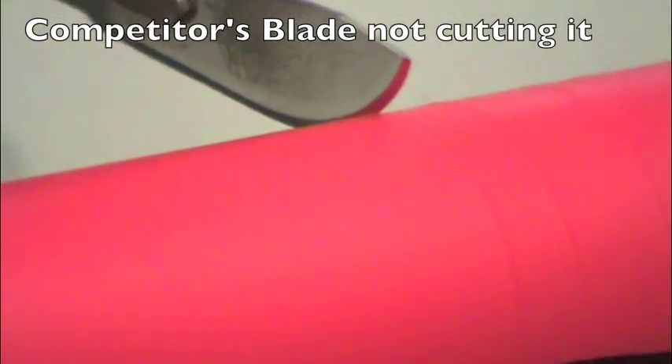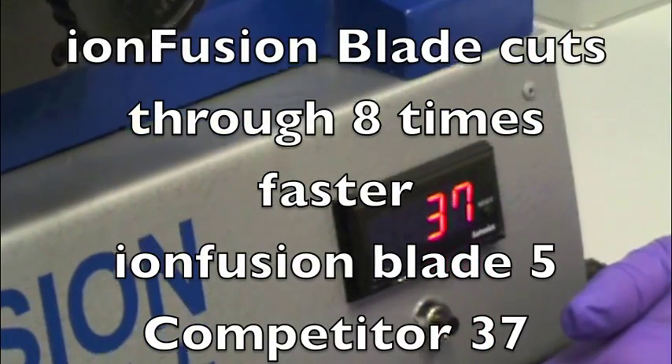As you can see, it took 37 revolutions for the competitor to cut through the test media.